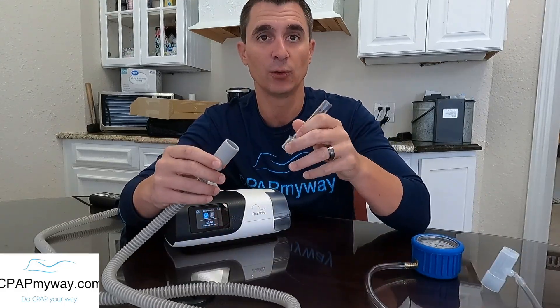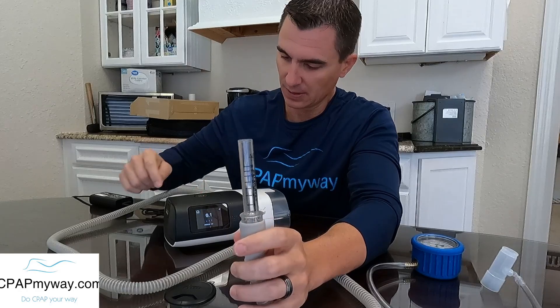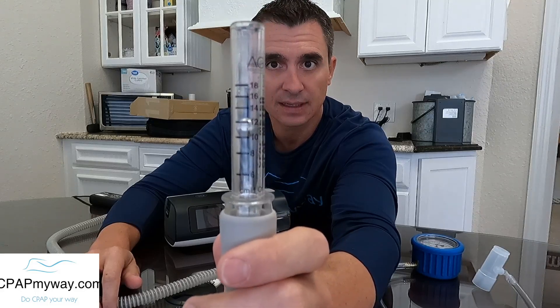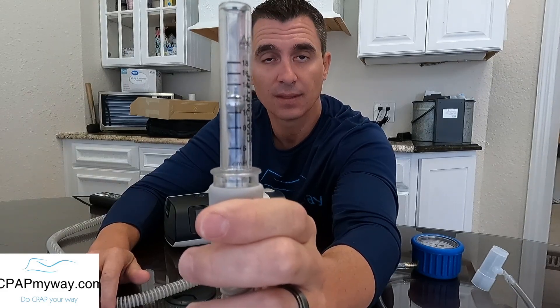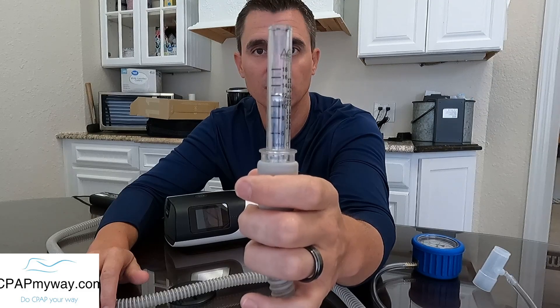Now I'm going to show you on the home version manometer what that looks like. You just attach it — there's nothing to cover on this one — and you crank your CPAP up. As the machine turns on, you'll notice that little silver ball going up, increasing until it hits the max pressure. We can see the bottom of that ball is right at the 10, so you can verify your machine's accuracy at home. It needs to be held perfectly vertical — tilting it to the side or upside down will throw off the reading.